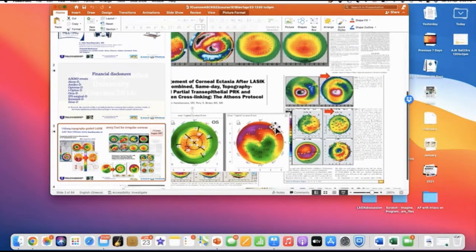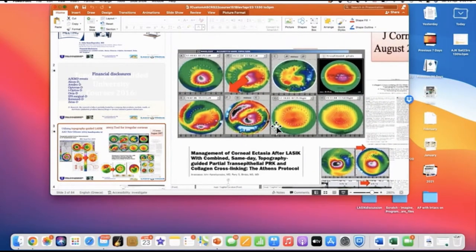So let's jump to keratoconus. This is a good prelude to what we're going to talk about now. Cross-linking a keratoconic eye, before and after. And we have an improvement of about 2 diopters. This is the difference. This is what we achieved with cross-linking alone. But still, the patient cannot function well here because he's contact lens intolerant, and he's spectacle corrected 20/60.